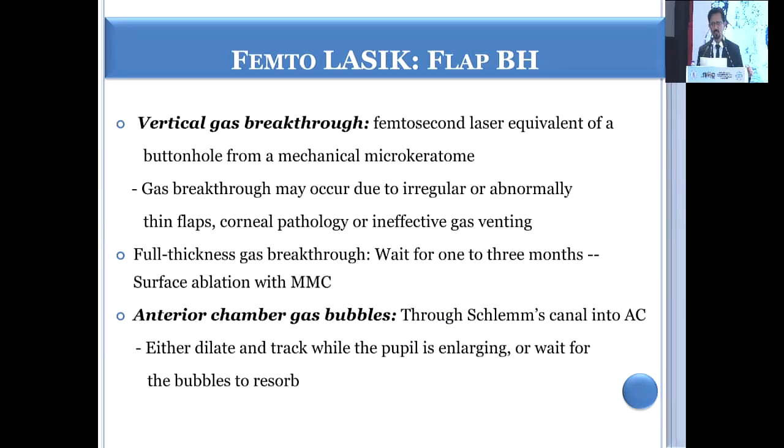It was just a thought that femto LASIK does not cause any buttonhole, but yes, it's extremely rare in comparison to microkeratome. Even in microkeratome, if the keratometry etc. is fine, then the risk of buttonhole is very less.